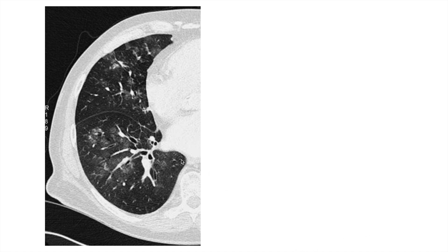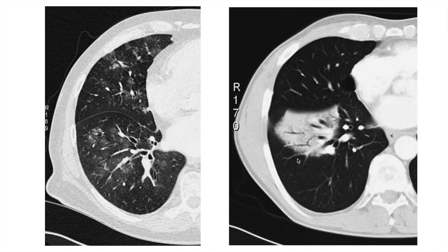Here we can see mild involvement with increased attenuation visible across the lung, but not associated with obscuring of blood vessels and airways — they are all clearly visible. This is ground glass opacity. In consolidation, bronchial and vascular markings are gone, though the lumens of the bronchi may still be visible. These are called air bronchograms, which are more pathognomonic of consolidation.